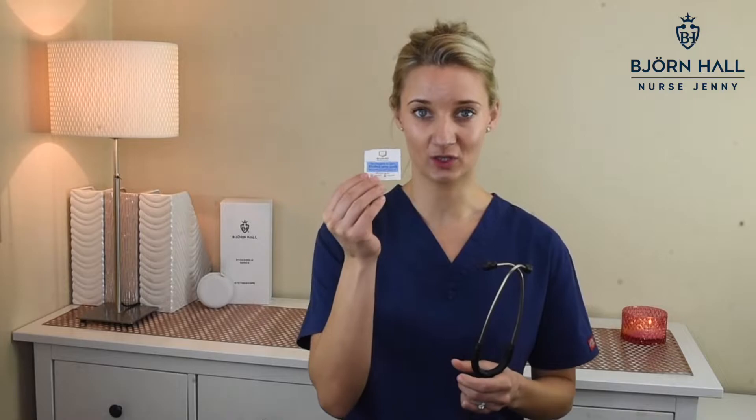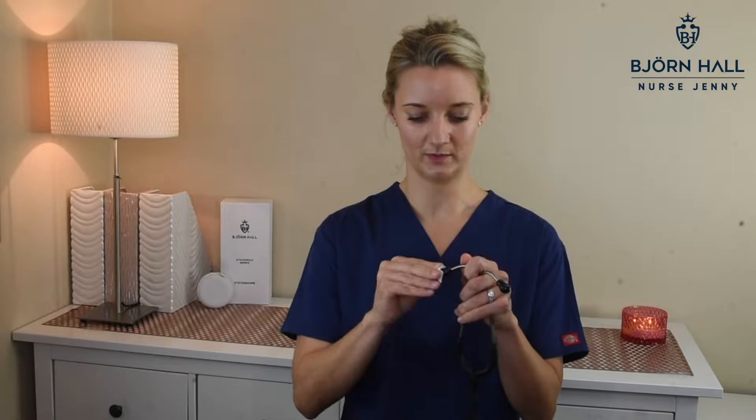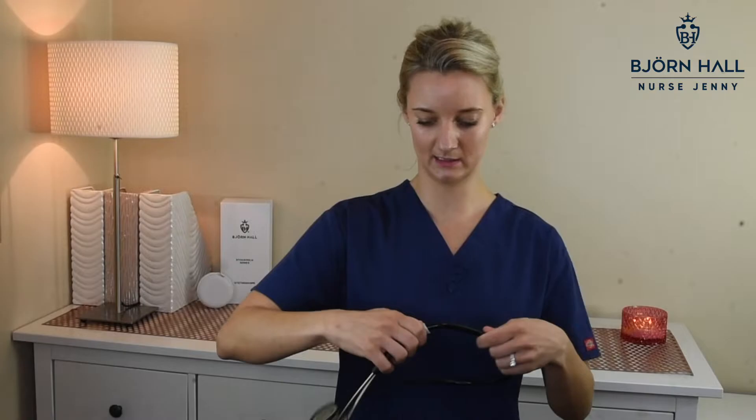I'll quickly show you how I would clean this stethoscope between each patient use — this won't be a thorough clean, but it's one you do many times a day. I would use one of these alcohol prep pads which has got 70% isopropyl alcohol in it. I always keep it in my pocket, most nurses do. I would clean the ear tips, just rub it around, clean the diaphragm because that's been on the patient, clean it around. Then I'll just give the tubing a little rub down. Let it dry completely and then it's ready to use for the next patient.